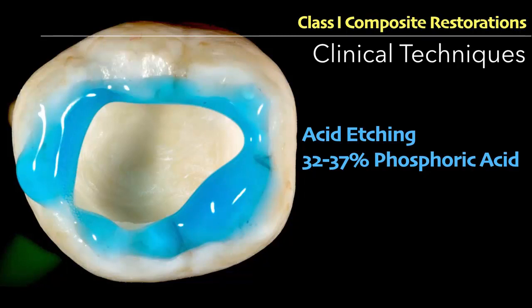It's also a system that limits post-op sensitivity. There is no post-op sensitivity when you use a self etch system. So guys, total etch for the enamel and self etch for the dentine, and the time is about 20 seconds. For total etch, 37% phosphoric acid is a very common thing. It's available in the market. It's the most common thing you can find in any clinic.